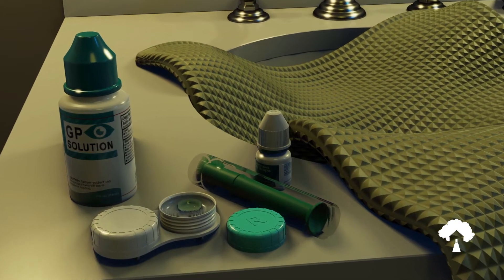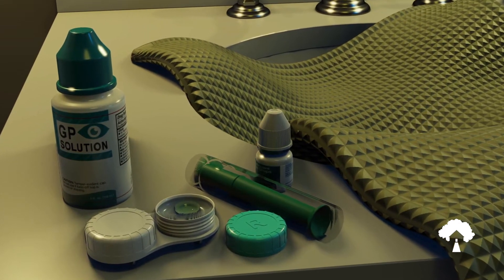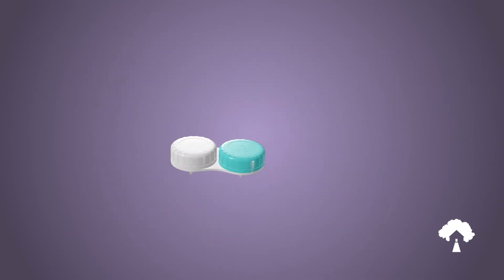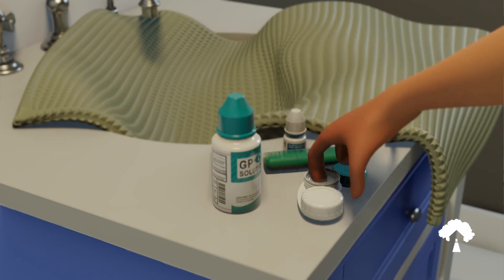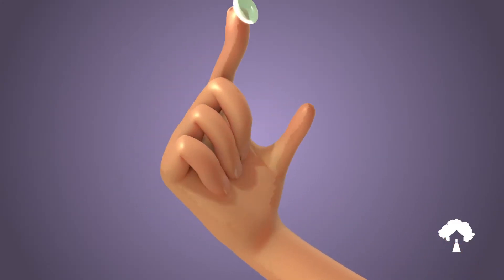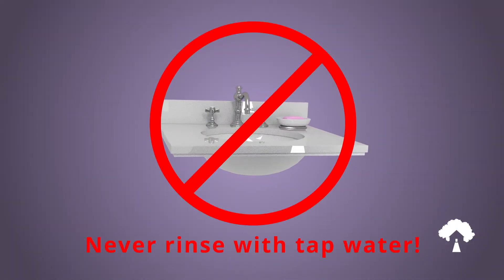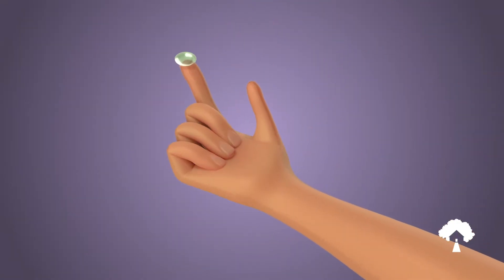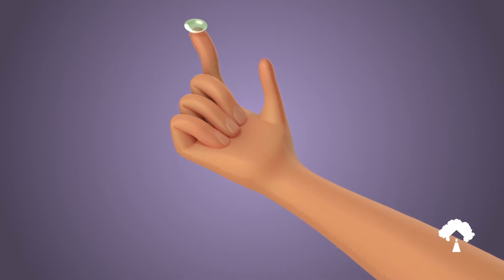Open only one side of your contact lens case and remove the first lens. It is recommended to always start with the same eye each time to help avoid mixing up your lenses. Remove the lens from the case and place the lens on the tip of your dry index finger with the bowl of the lens facing upwards. Very important: never rinse the lens with tap water after removing from the case. The lens may be rinsed with saline or your approved gas permeable solution if needed. Inspect the lens for cracks or chips.